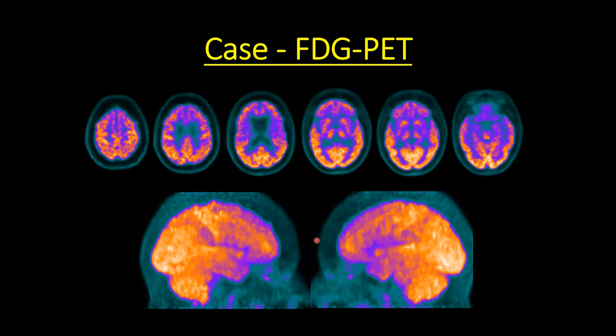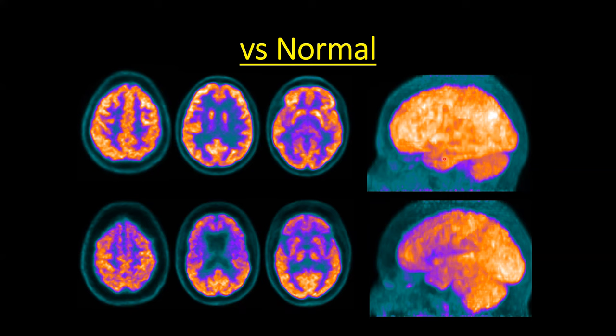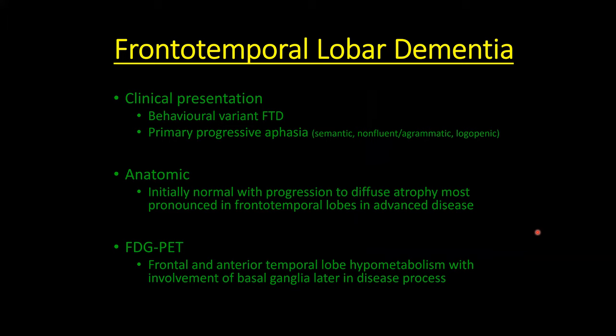And so we did, again, an FDG PET study, and we see, unlike our last case, that there are areas that look a little bit more purple, have some hypometabolism compared to other areas. If we look at the brain here, we see predominantly the frontal lobes bilaterally are involved. We see the temporal lobes bilaterally are involved as well. So we have a frontal temporal pattern of hypometabolism. Just to compare this to our first case, we had our normal uptake, and now in this case, frontal temporal hypometabolism, and really in conjunction with the clinical picture, this is in keeping with a frontotemporal lobar dementia.